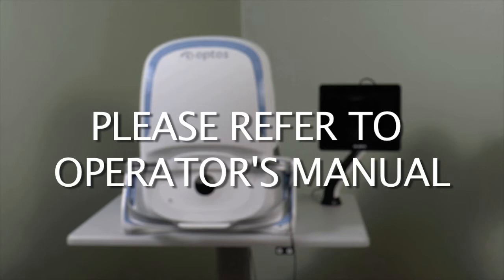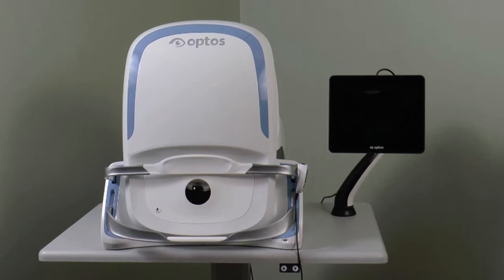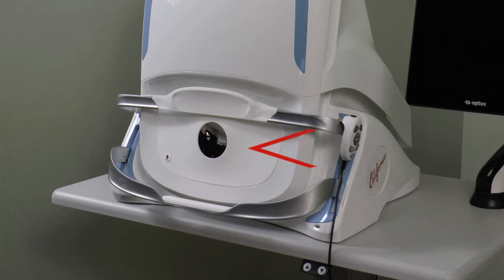Let's review the different parts of the California device. This is the scan head as it sits on the height-adjustable table, along with the touchscreen tablet, and these are the forehead bar, face pad, chin rest, and hand controller.